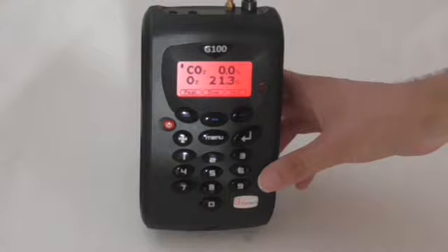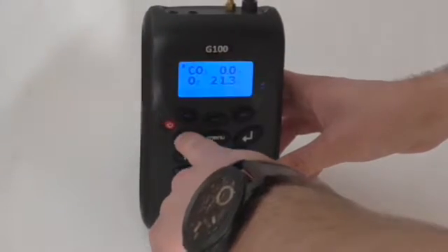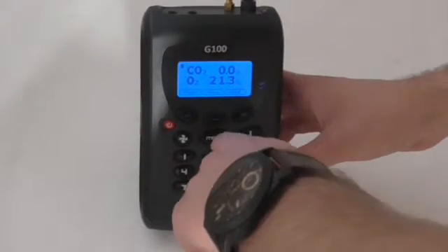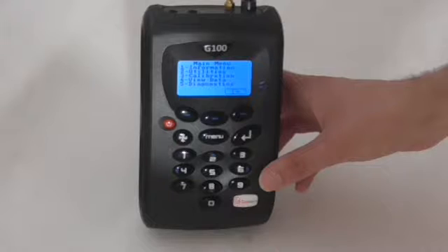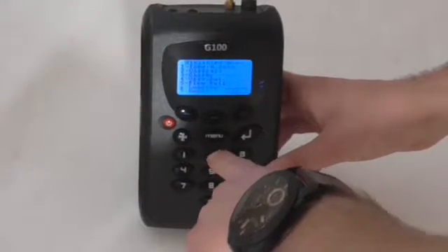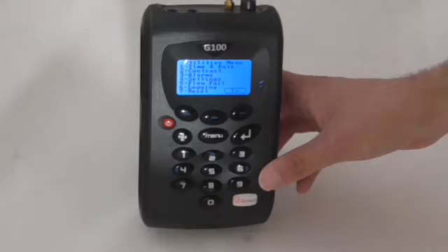Once you've ensured there is no blockage or restriction, you may have to adjust the flow fail point. To do this, press the menu key, key 2 for utilities, and then key 5 for flow fail.